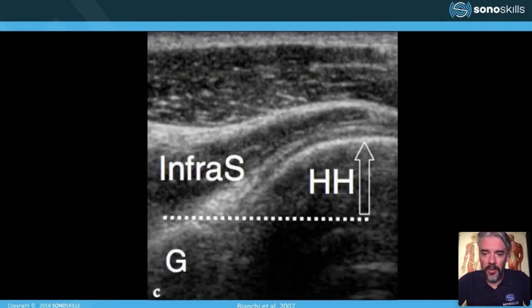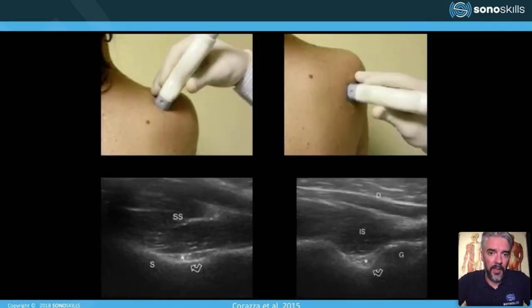I mentioned last week or the week before about the luxation or subluxation of the humeral head sometimes being missed. I mentioned also I saw it several times in various settings. This is the height that it should be. So the humeral head, the top should be higher than the glenoid cavity, and this leads to the infraspinatus being oblique, a little bit of anisotropy, and therefore also more hypoechoic.